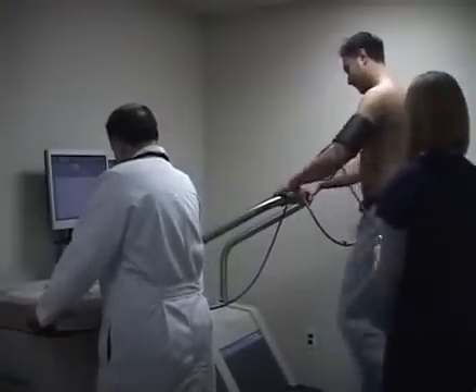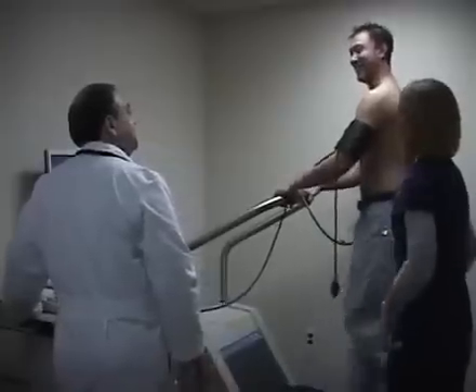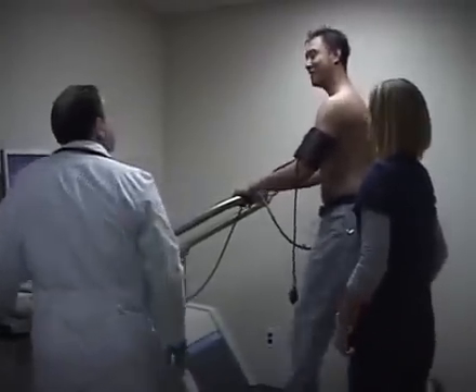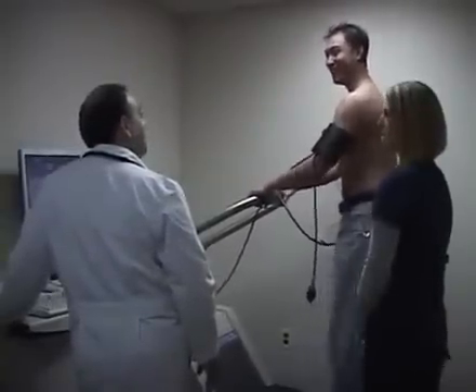At every stage, we check the blood pressure and monitor the electrical activity of the heart. If there is a blockage in any of the arteries in the heart, during exercise as the heart rate goes up, there is not enough blood circulating through the heart. As a result, there are EKG changes that we will detect.